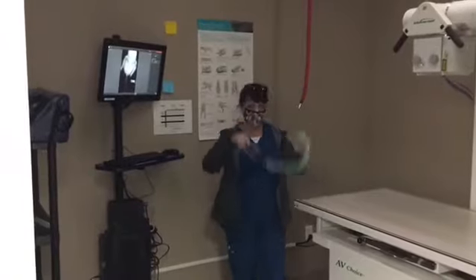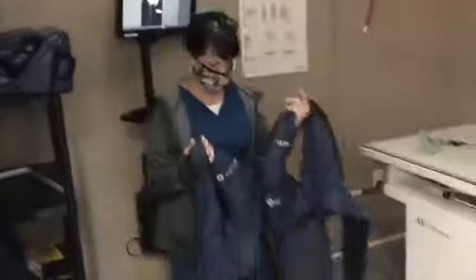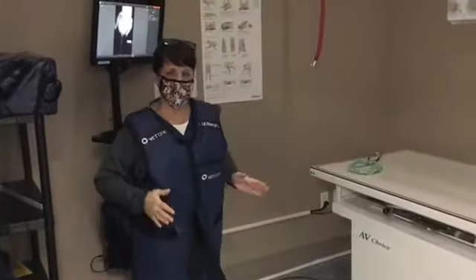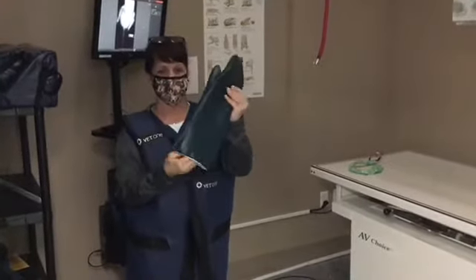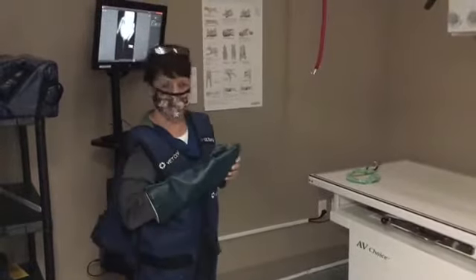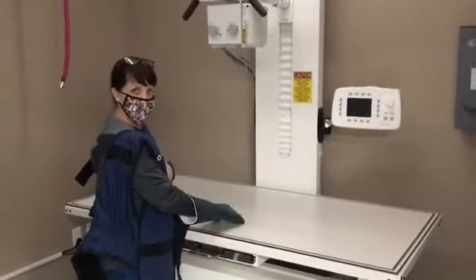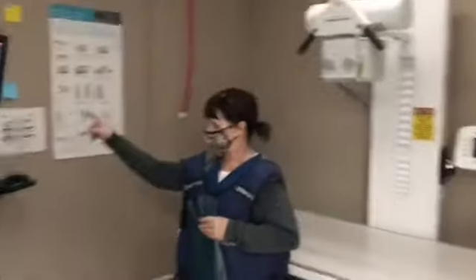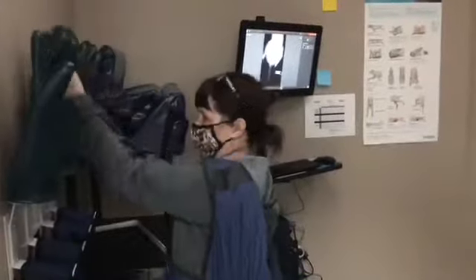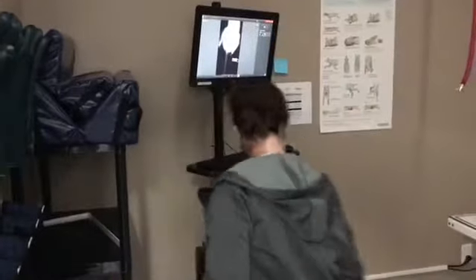Okay, so this room here is the x-ray room. This is a place where if your pet needed some x-rays done, we would take them, and so I put on protective gowns and gloves to protect myself when we're doing radiographs with the patients. So the dog and the cat would be on this table here, and we would hold them in place and then shoot an x-ray. So when the x-rays are taken, they come up here on the screen, and I will show you an x-ray of my cat that we took earlier.